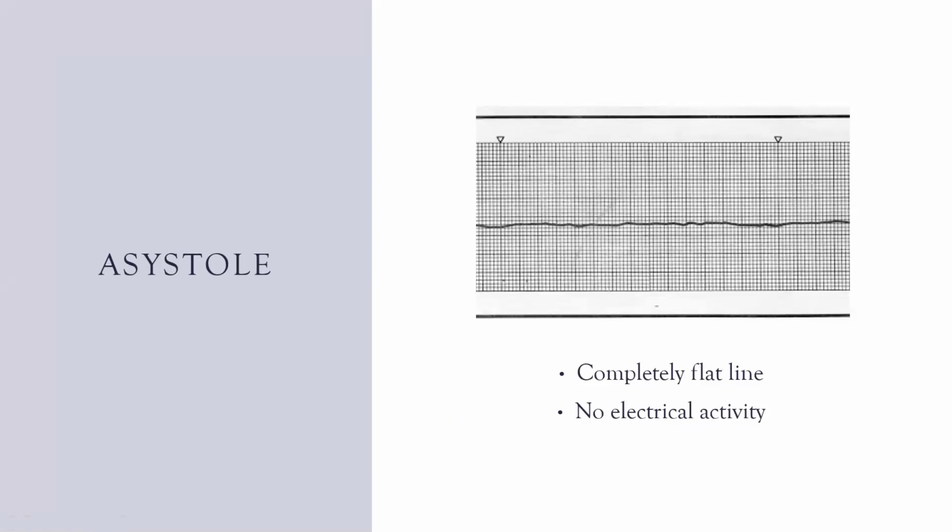The monitor looks beautiful, but you look over and your patient is dead, y'all. Your patient has no breathing, no pulse, completely unresponsive. They are dead. Okay, so pulseless electrical activity means there's still electrical beats in the heart, but there is no physical muscle contraction, which is totally plausible.